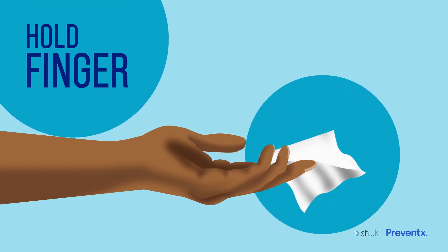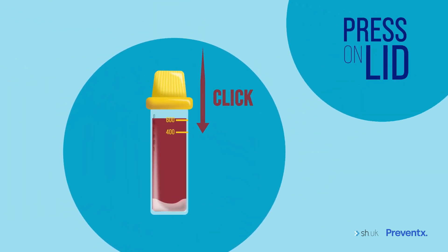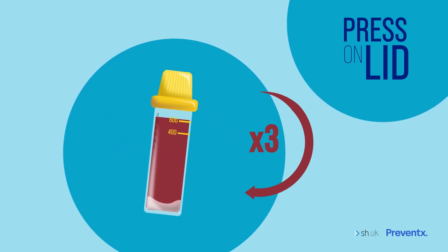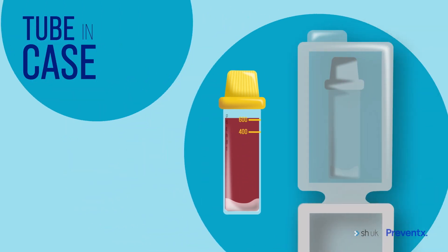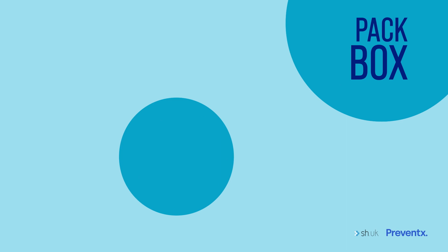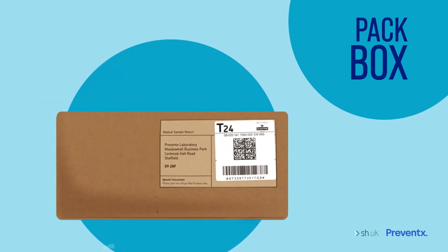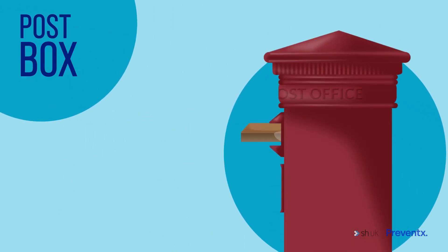When you've finished, hold your finger firmly with the tissue until the blood stops. Finally, press the lid on the tube until it clicks, then gently turn the tube upside down three times and make sure you wipe down the tube if there's any blood on the outside. Place the tube in the transport case and put your sample in the box with any other samples from your kit. All you need to do now is put the package in any post box, and because it's free to return, you don't need to worry about stamps.